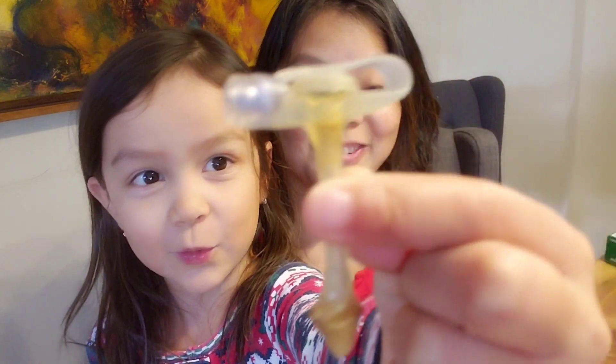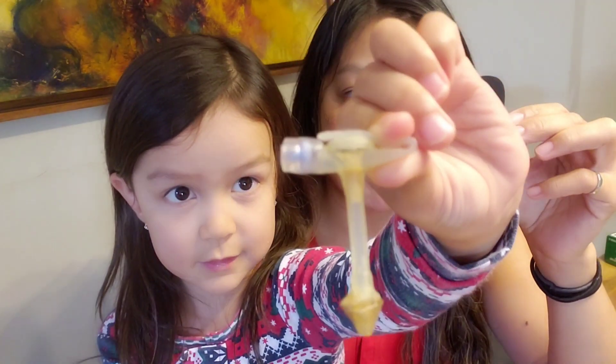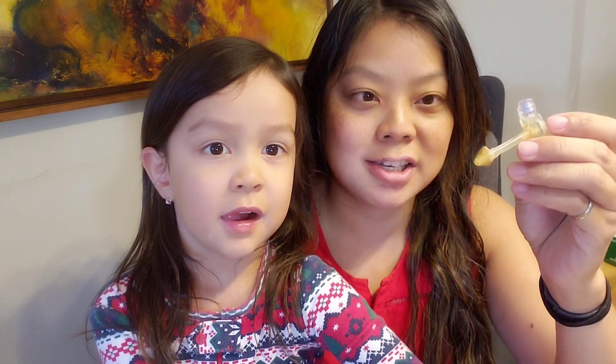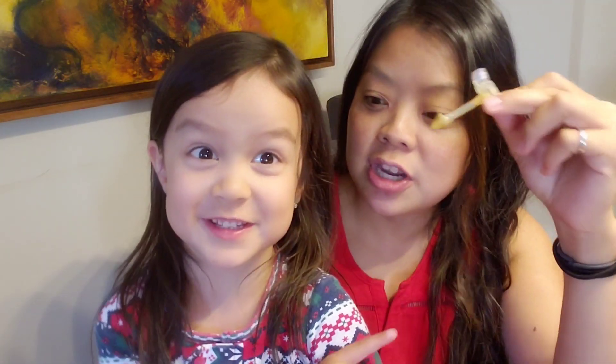Hey everybody, in today's video we're gonna have a little bit of fun. Kylie and I are going to do a little experiment — we're going to see how much water this balloon button can hold. We hear about balloons or buttons bursting all the time. Magnus has a 14 French, 3-centimeter button which we just changed, so check out that video if you haven't seen it yet.